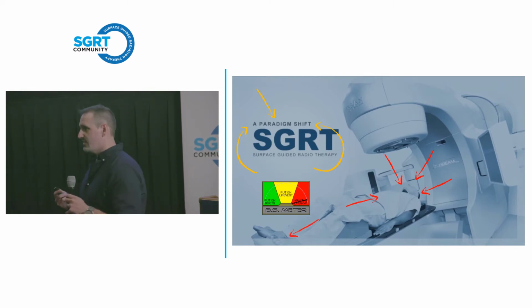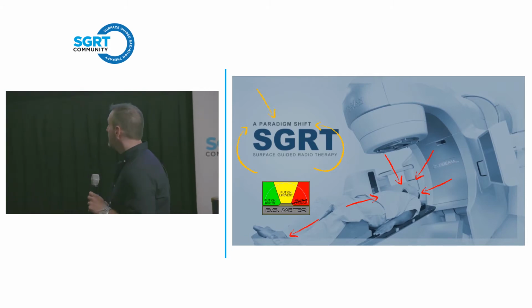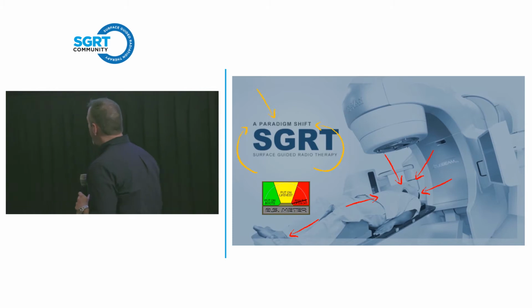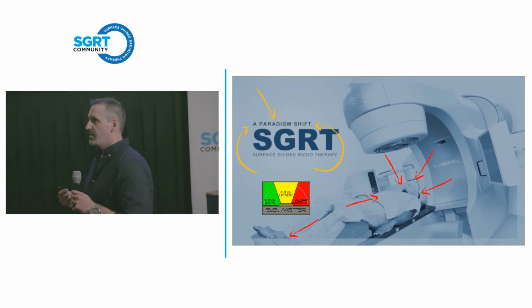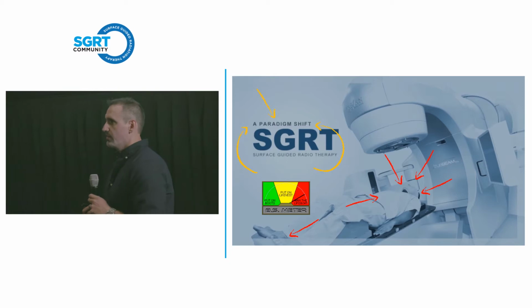But when you see a flyer like this and it says SGRT and you see things like a full face mask, and wait a minute, his entire body is covered with a t-shirt and the only surface I find is the tops of his feet, you tend to be a little bit skeptical. And so I hear people come in, they've had these presentations and they tell me, hey, I don't believe that the surface correlates to the internal target position. And I say, yes, you do.